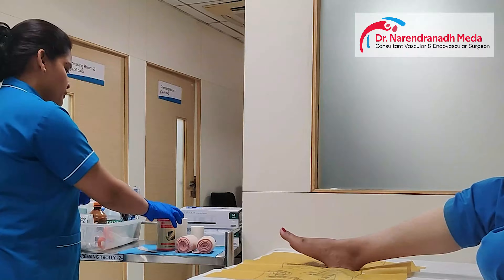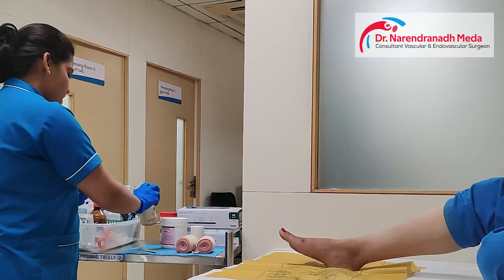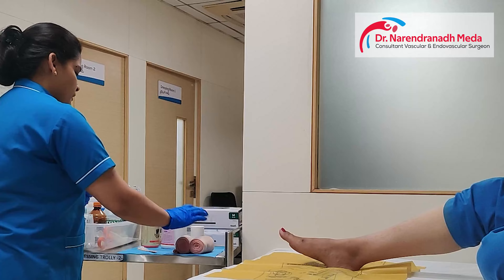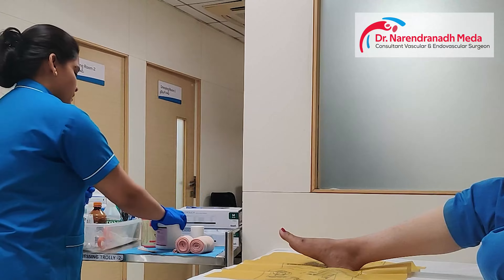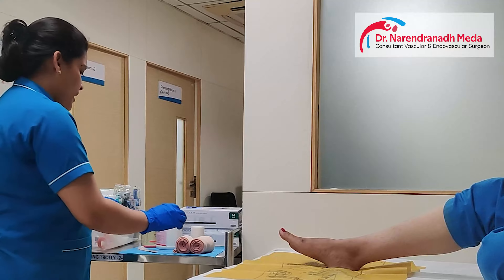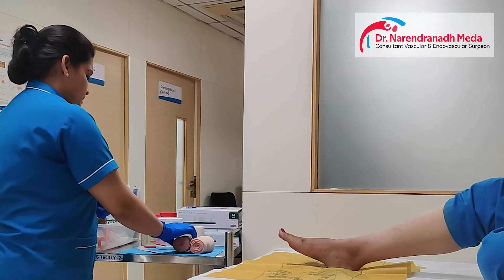Double crepe bandage, two crepe bandages, Vaseline, paper plaster and double crepe bandage. And the Vaseline, okay.